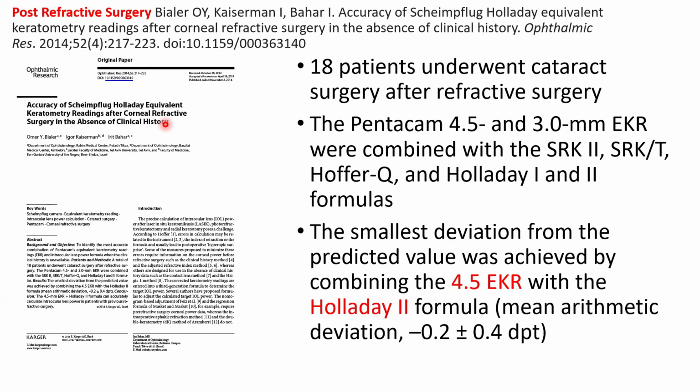They said the smallest deviation from the predicted value was achieved by combining the 4.5 EKR with the Holladay 2 formula. So across studies, they have found that the 4.5 mm zone of the EKR gives the best values.